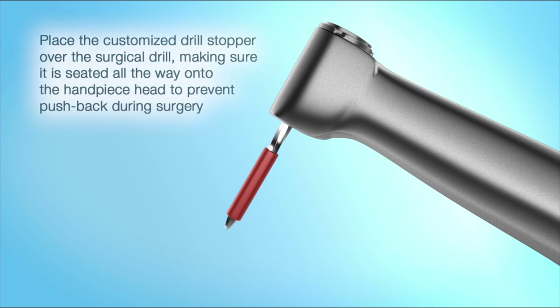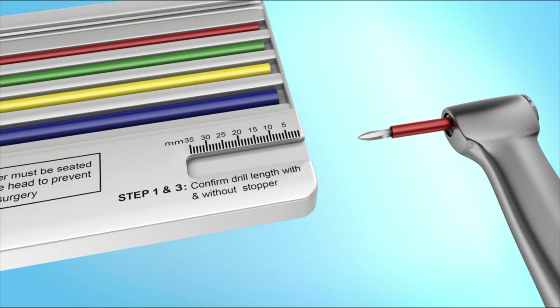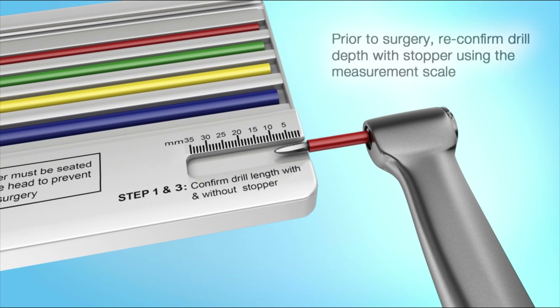Place the customized drill stopper over the surgical drill, making sure it is seated all the way onto the handpiece head to prevent push-back during surgery. Prior to surgery, reconfirm the drill depths with the stopper using the measurement scale.